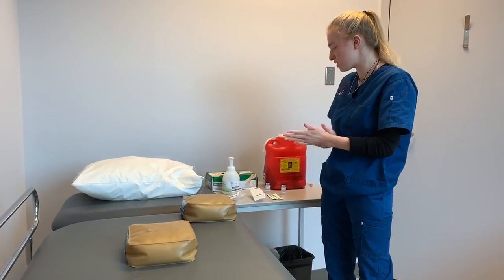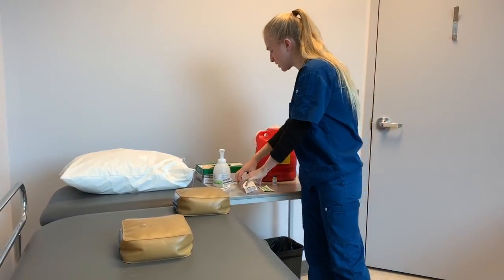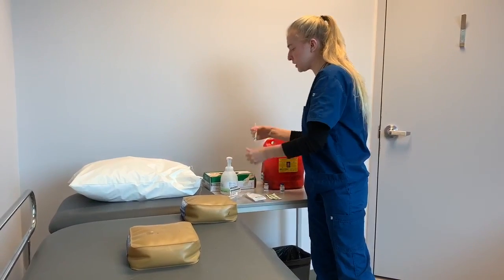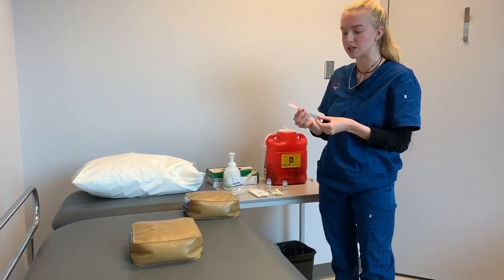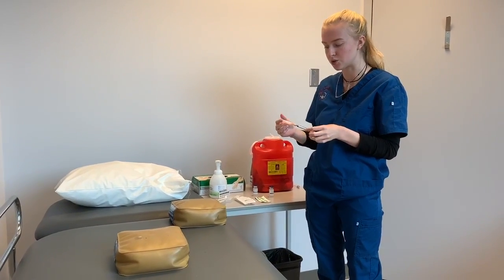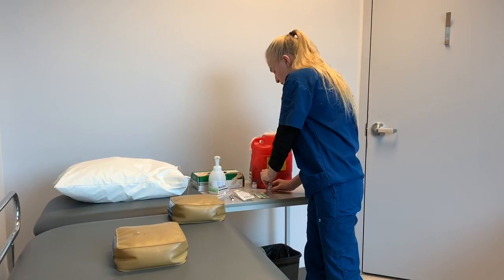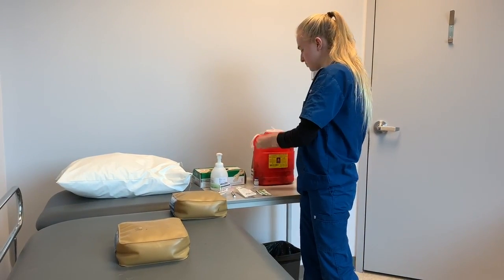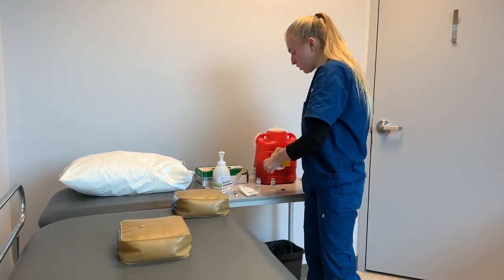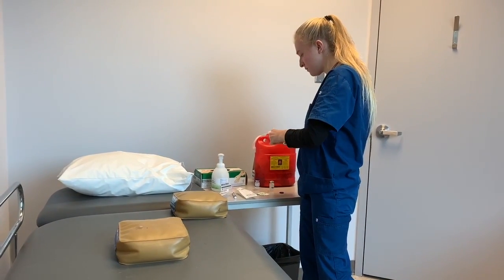Okay, so I'm doing my subcutaneous injection of heparin first. So I'm going to use my 1 milliliter syringe because I'm injecting 1 milliliter of heparin. And I'm using the 25 gauge needle because it's a shorter needle. So before I prepare it, let's prepare my vial. So I'm going to take an alcohol swab and swab the top of it.